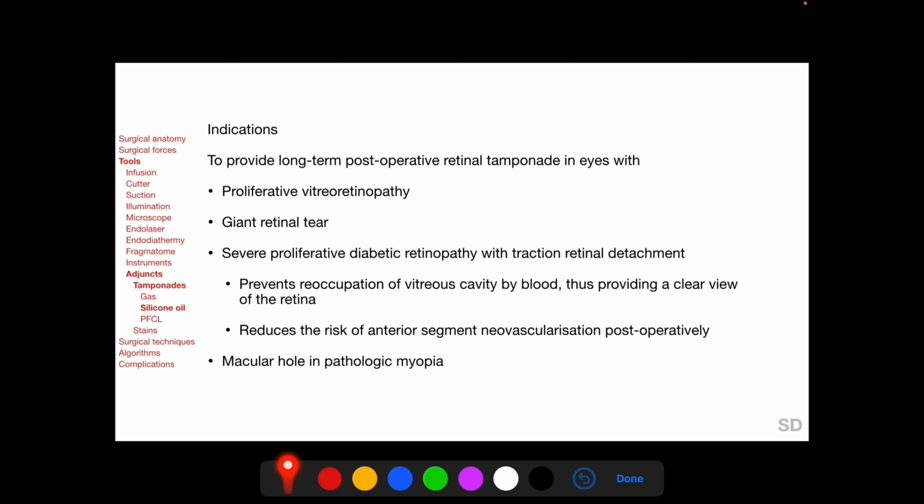Cataract develops in a high proportion of phakic eyes undergoing silicone oil tamponade. In phakic eyes with or without cataract, phaco-vitrectomy is often considered if silicone oil injection is planned or anticipated. Polymethyl methacrylate or acrylic intraocular lenses should be considered in this situation, while silicone intraocular lenses are contraindicated, as silicone oil tends to adhere to the posterior surface of these lenses through a posterior capsular defect, and this addition of silicone oil to the posterior surface of silicone intraocular lenses severely disrupts visual function, and this is very important to remember.